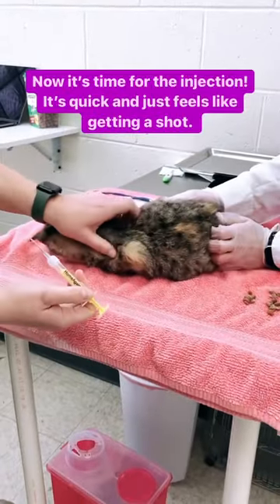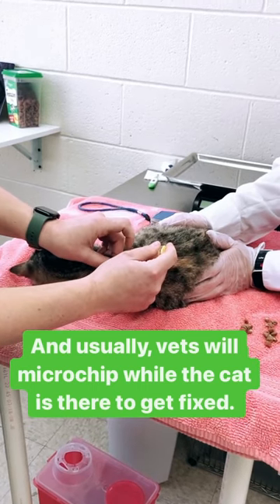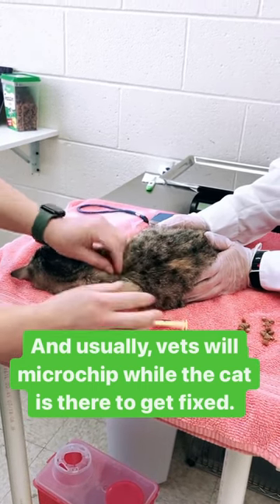Now it's time for the injection. It's quick and just feels like getting a shot. And usually, vets will microchip while the cat is already under anesthesia.